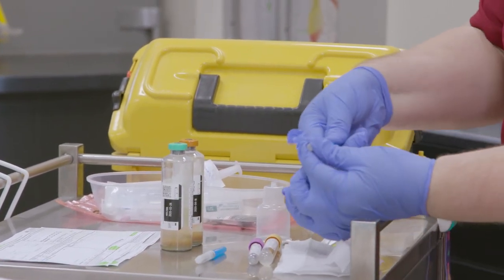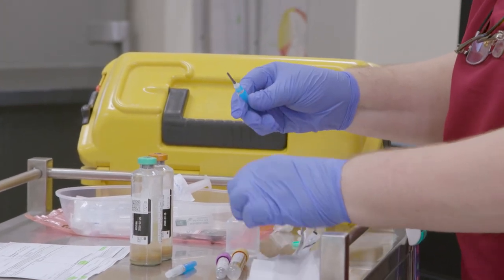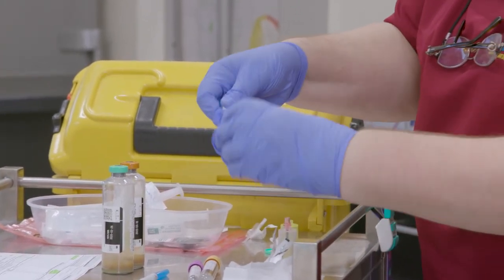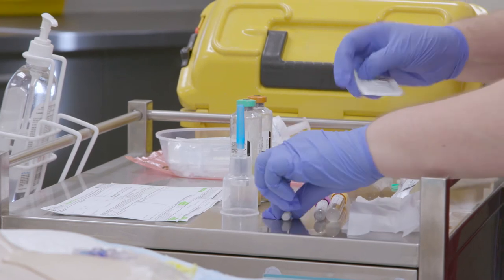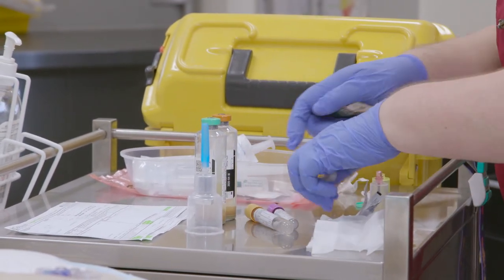Using your non-touch technique, open up your Vacutainer needle. Pop that into the Vacutainer. Just loosen the top and have it ready to go. And now you're ready. Make sure you have everything ready to go in sequence. You're ready to collect your blood.